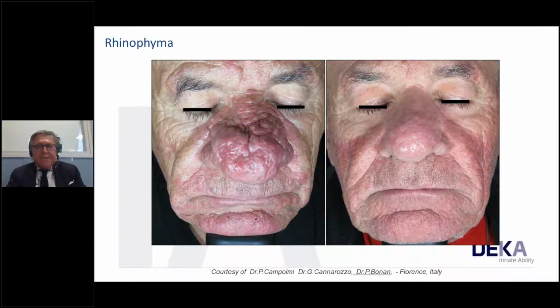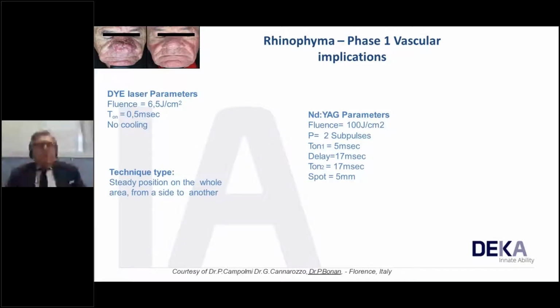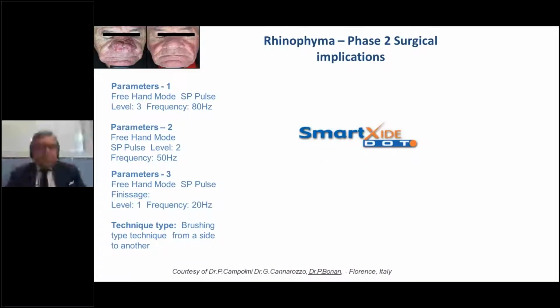What is interesting is the front view, side view, and the bottom view. We can appreciate the total restoring of the texture and even the capability of the patient to breathe better, because we can vaporize at the best by using these parameters.